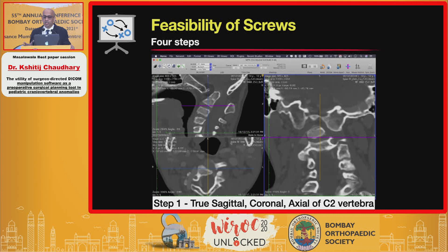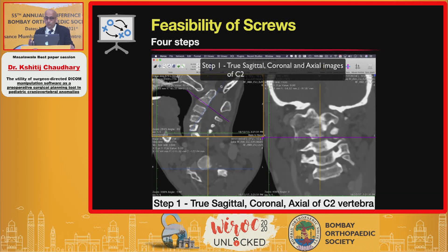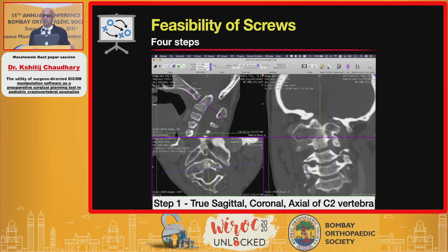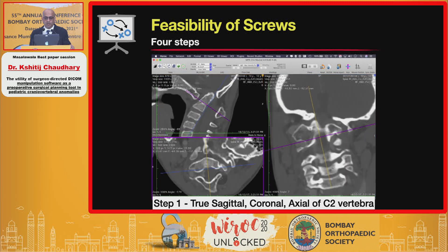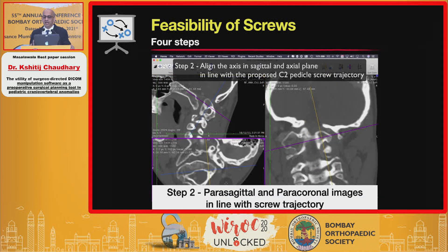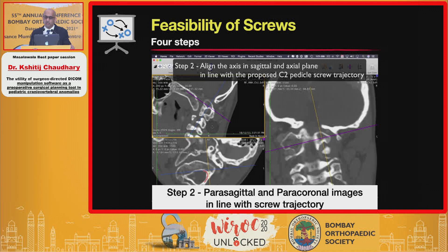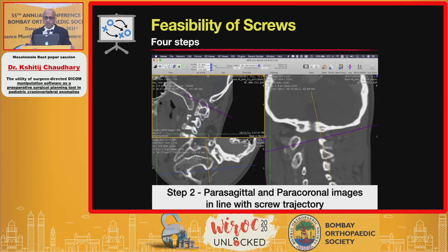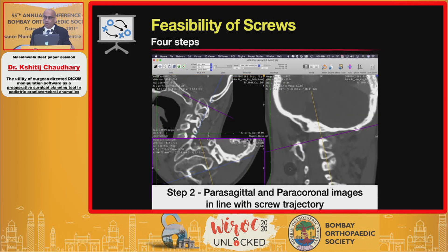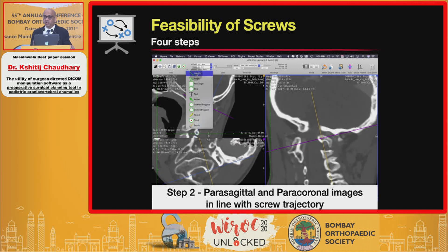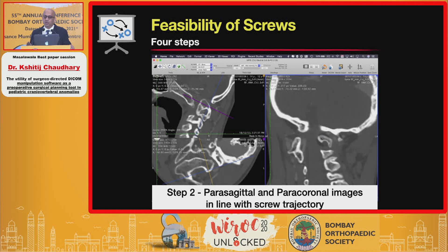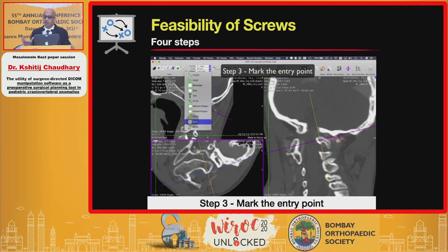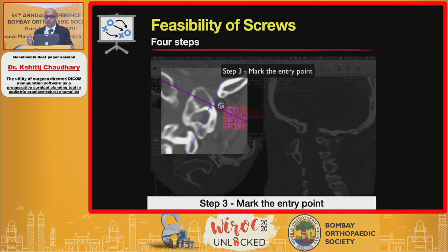Screw feasibility was checked using MPR in four steps. First, the axis was moved to obtain a true sagittal, coronal, and axial image of the C2 vertebra. Second, parasagittal and paracoronal images were created in line with the screw trajectory. When the axis was aligned with the proposed screw, the paracoronal images were scrolled to the narrowest width — if the diameter exceeded 3.5 mm, it was considered suitable for a 3 mm diameter screw.